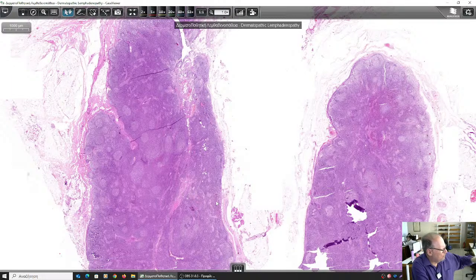The macrophages take the melanin. Remember how coarse the melanin pigment, coarse granules appeared in the cytoplasm of macrophages. Then macrophages enter the circulation, go to the regional lymph nodes, and they expand the T zone.